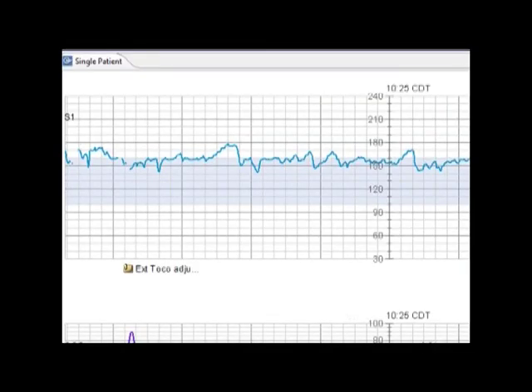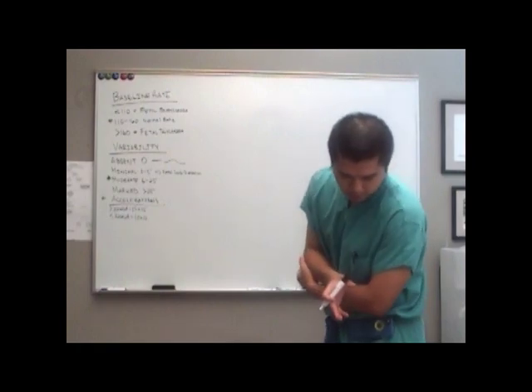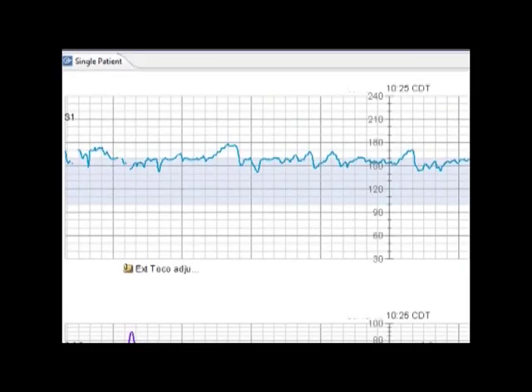So this next heart trace is an example of acceleration. So are there accelerations here? So let's assume that this patient is greater than 32 weeks gestational age. There are accelerations. If you call your baseline rate 150s, there's at least 3 or 4 obvious accelerations in there that you can pick out just looking at it quickly.